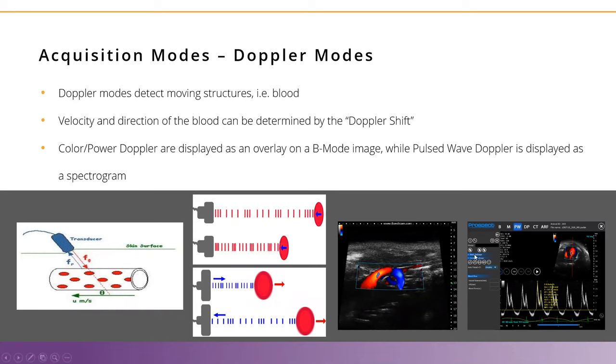We can use these then to take a look at the flow through the heart, and we'll look a little bit more detail into this, but basically on this scout window that we saw previously, we're going to have a color Doppler image. That's the last one as we switched into pulse wave Doppler. And we're going to place a sample volume within the jet that we're looking for. And here we're specifically looking at the jet coming through the mitral valve. So going from the left atrium into the left ventricle. And this is a very characteristic waveform of that flow velocity.